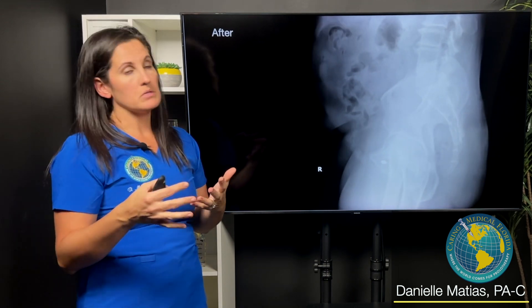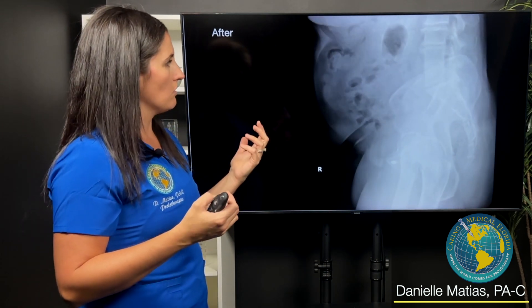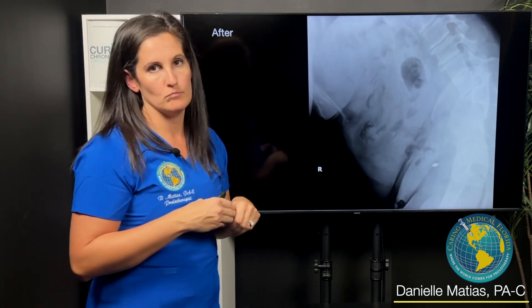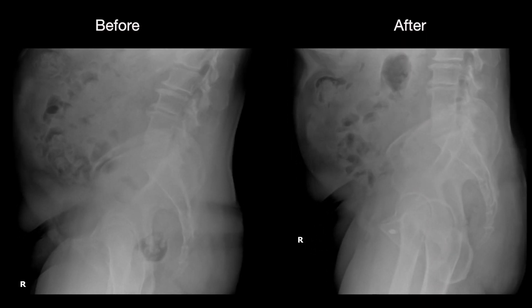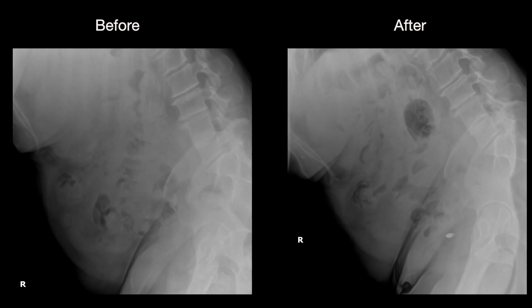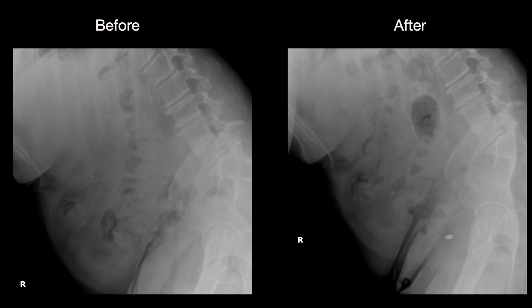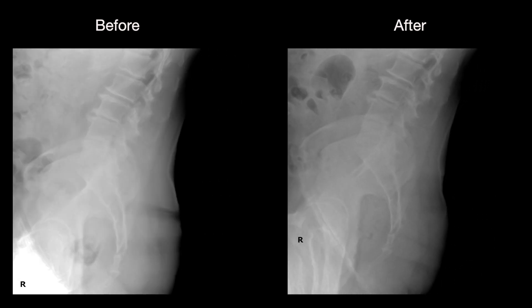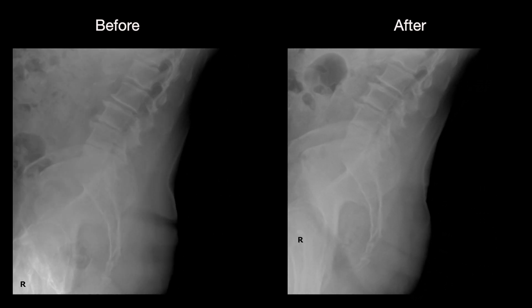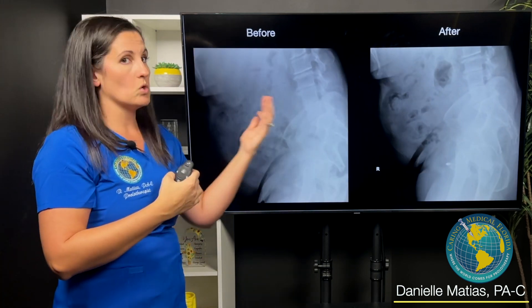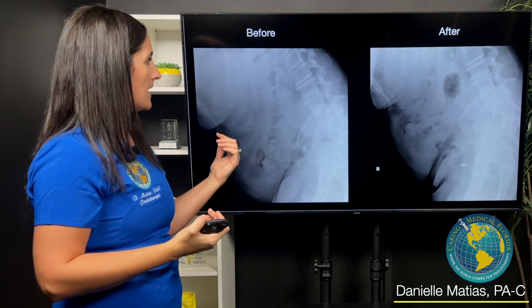After this patient has completed several rounds of prolotherapy, this is their latest x-ray. The video is slowed down — we don't make the patient move this slow. What we're looking at is when this person moves, are there vertebrae that slide out of place, whether that's forward or backward, as they're moving. A lot of times patients initially, when they're standing, don't look like they have big spondylolisthesis or vertebrae out of place — it's more so when they're moving that we actually pick up on this.